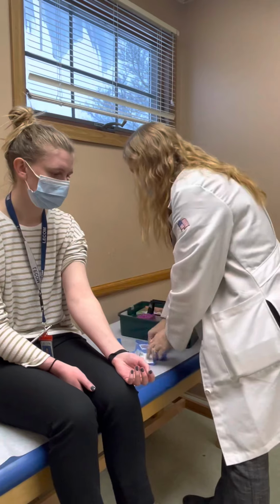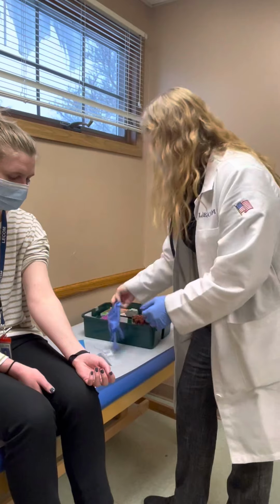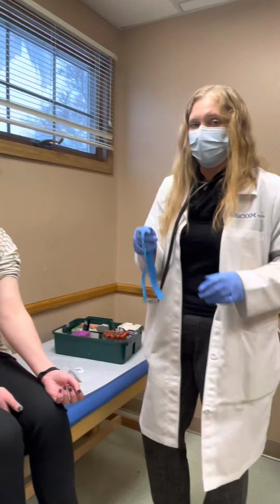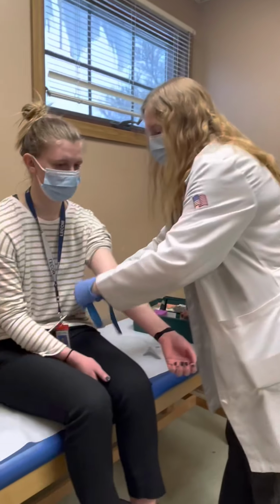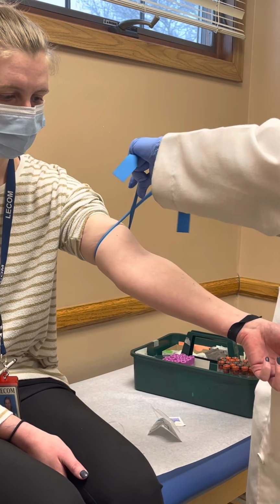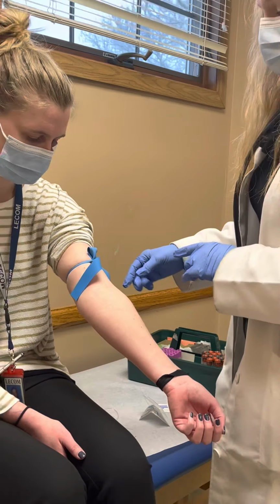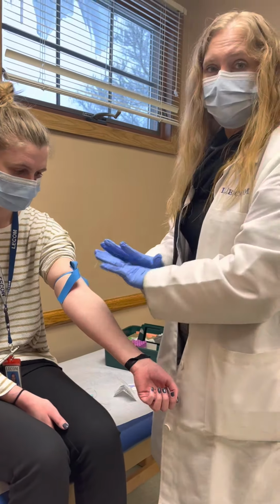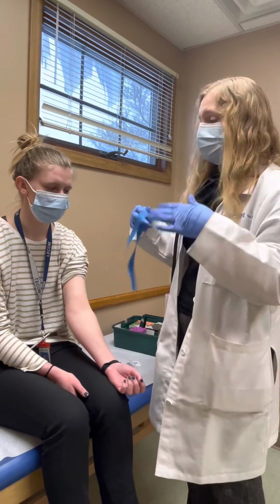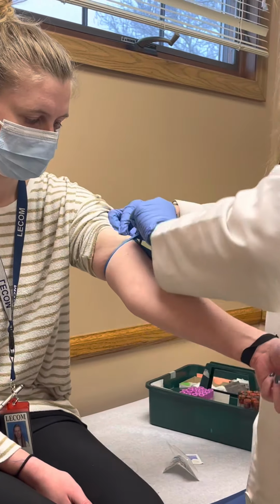The next part is you want to put on your gloves before you do anything, because when we apply the tourniquet, it's kind of painful and the person does not want to sit there for a while with the tourniquet on their arm. So tourniquets and Band-Aids are the hardest part of drawing blood. When you apply a tourniquet, you're going to pull it as tight as you can. You're going to make a cross at the skin like an X, and you're going to tuck one side. That's it. You want to do this so that in case someone's having a lot of pain or freaking out, you can easily just pull it and the whole thing comes off. You don't want to put a knot in there. You don't want to tie a bow in there. It's just a quick tight X and tuck one side.